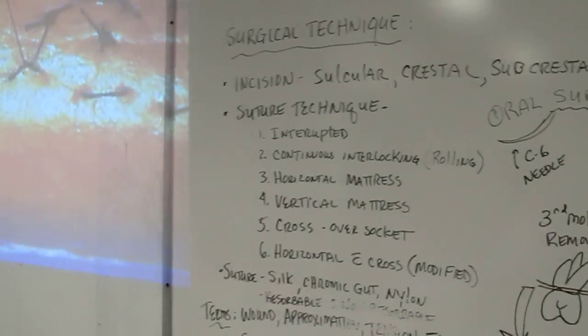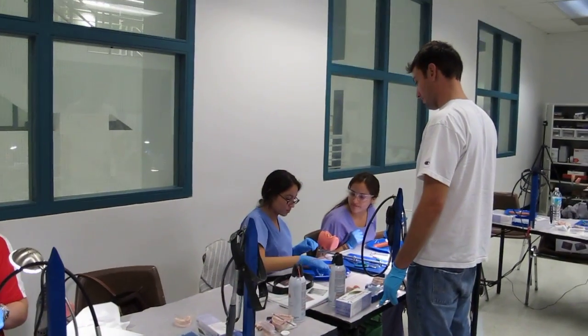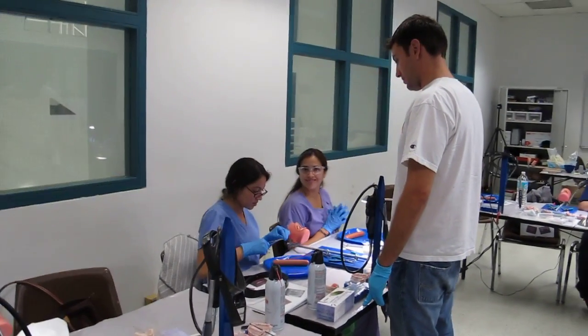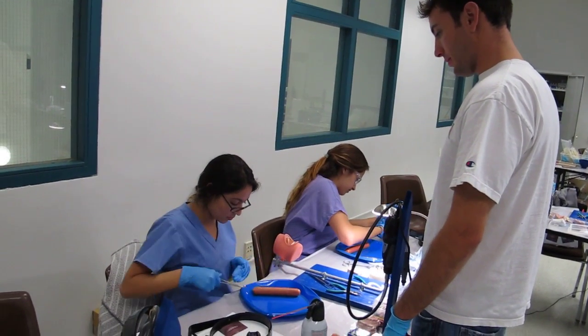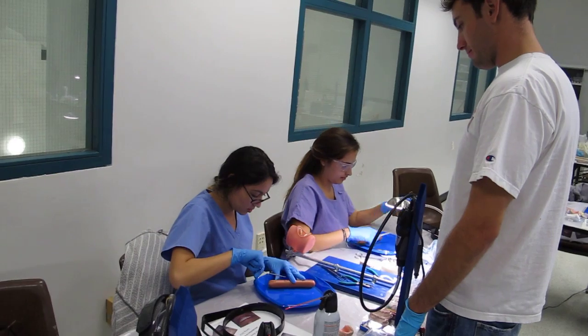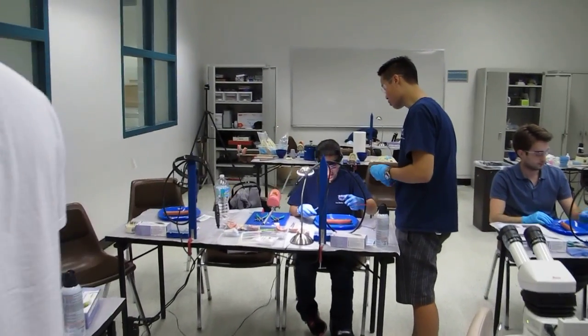Hi. Is it horizontal? No, it's good — we're going to do a horizontal mattress. Oh, that looks like this. That's good, we're going to go through. Yeah, it's easy. We'll just do that way. Okay. So we're going to leave a loop because we're going to go — cool.